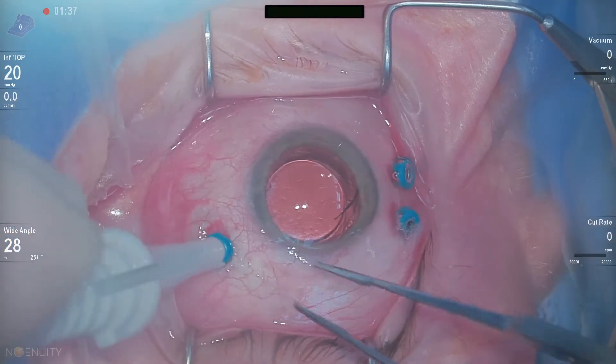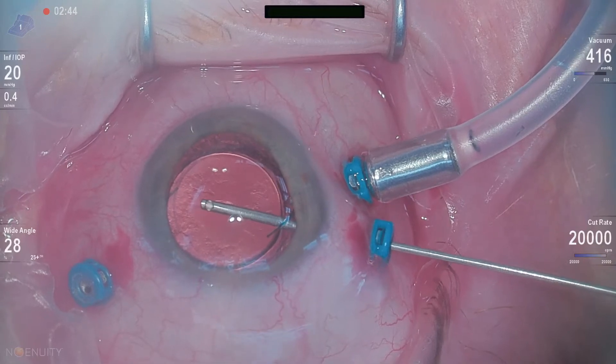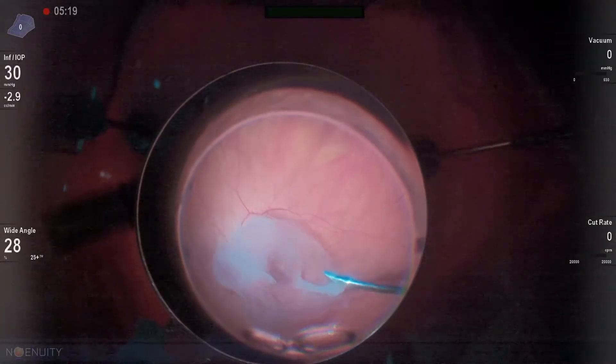The following is a vitrectomy for vitreomacular traction, and these cases can be really tricky. The vitreous can be very adherent and it can be difficult to induce a vitreous separation.